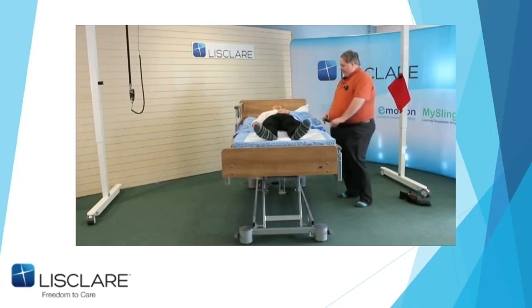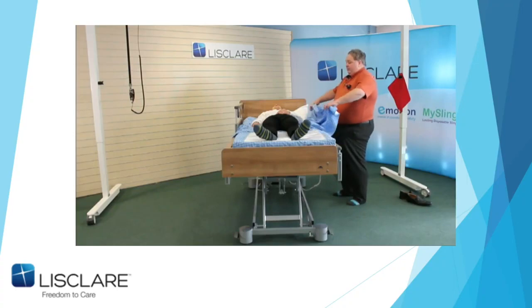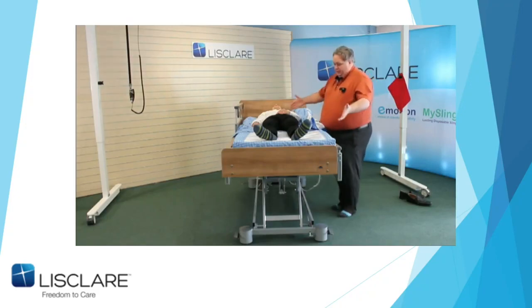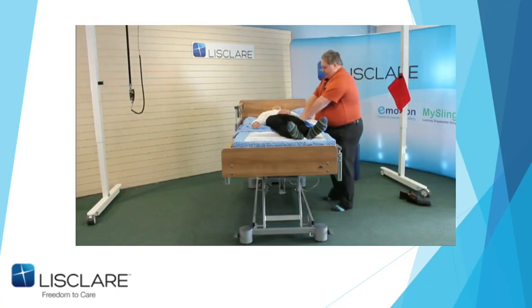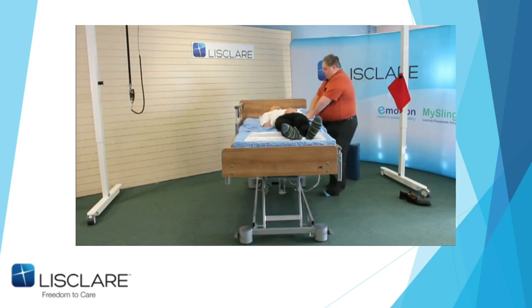Only kidding. So the first thing I want to do is turn John onto his right-hand side again. Now, I've done this with plus-size patients, but if there's two carers for a plus-size patient, they need to double team at the hips and then double team at the shoulders. If anybody's worked with me doing this, they'll have seen this. The first thing I'm going to do is slide John's legs out towards me. Then you'll see me working with a nice posture, bringing John's hips towards me, and then bringing his shoulders towards me.